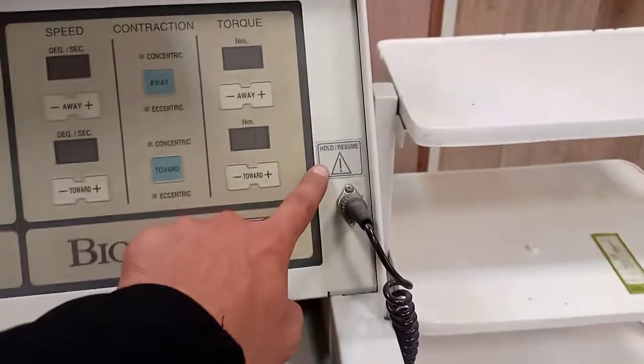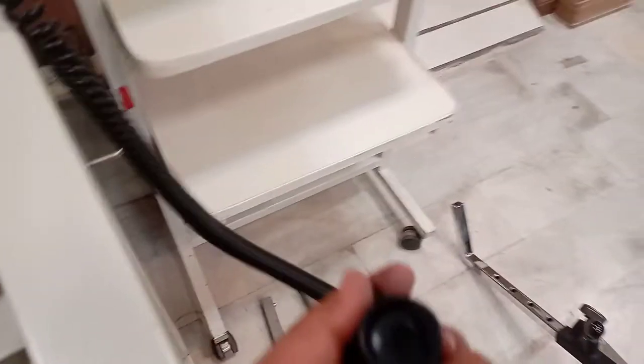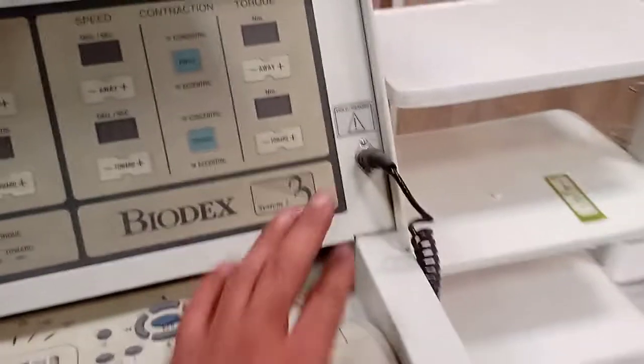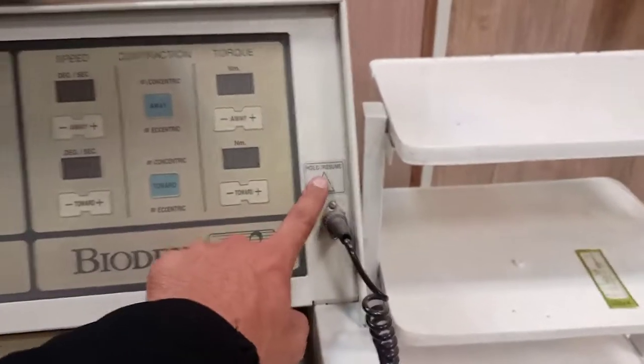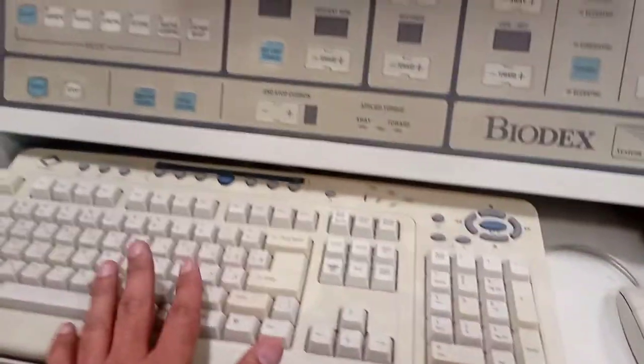This button is just a hold or resume button — it's a push switch so you press it to get the desired function. You can either hold the test or resume it. This is the normal mouse and keyboard, and the system has a built-in Windows 98 operating system.